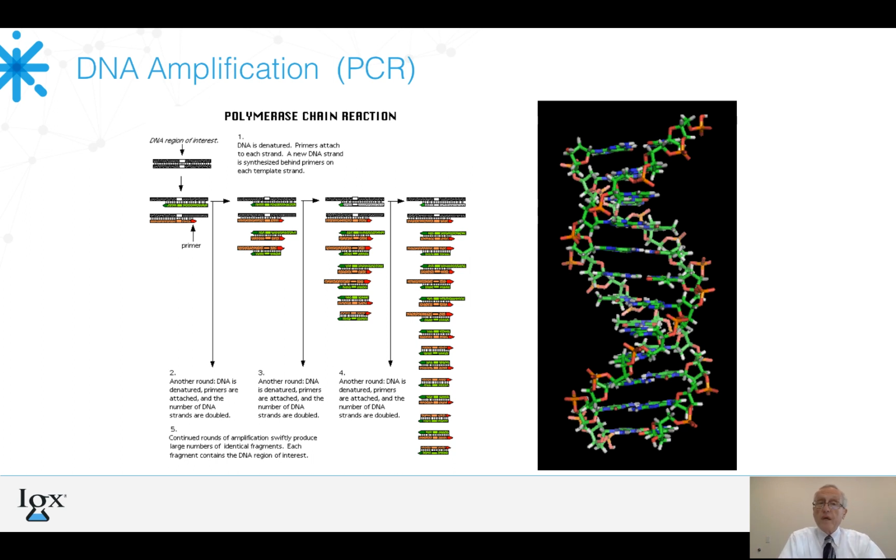For HIV and PCR technology, most labs use 25 cycles. For Lyme disease, IGeneX actually uses 50 cycles, so that we get a significant increase in the number of pieces of DNA that we can then Southern blot, which tells you, make sure that it is Borrelia burgdorferi or sensu lato strain that includes those specific DNA pieces that you have sequenced up and multiplied up.